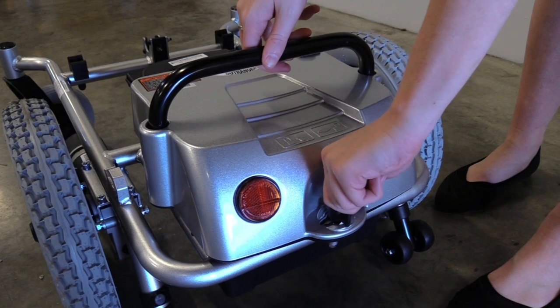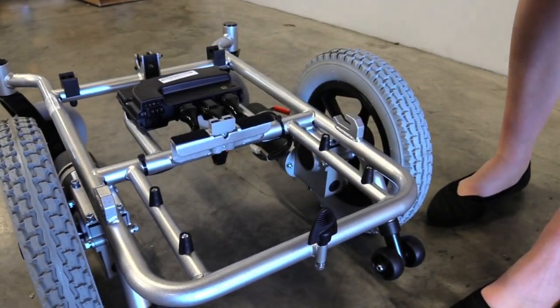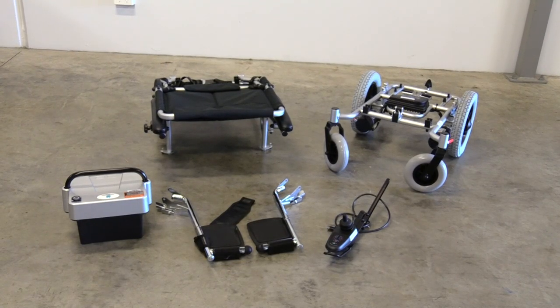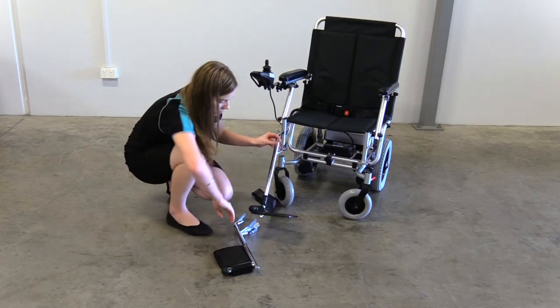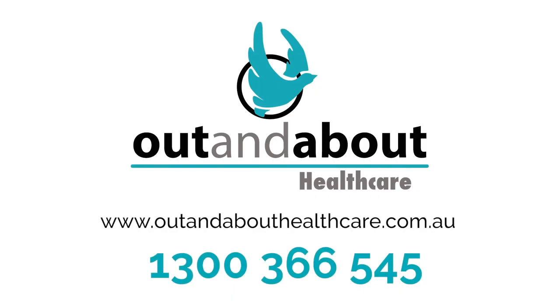To release the battery, turn the tension knob horizontally and lift the battery out from the mainframe. Your Puzzle will disassemble into five different parts. If you have any questions about your new Puzzle, be sure to refer to the manual or contact Out and About Healthcare on 1-300-366-545.